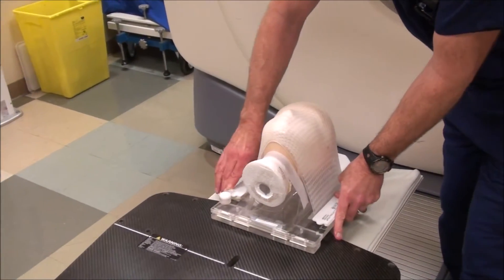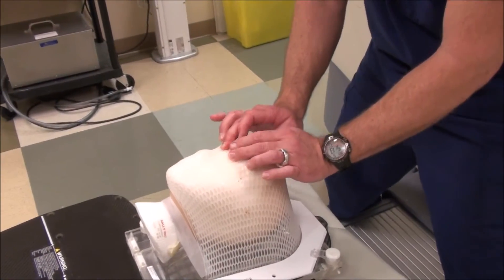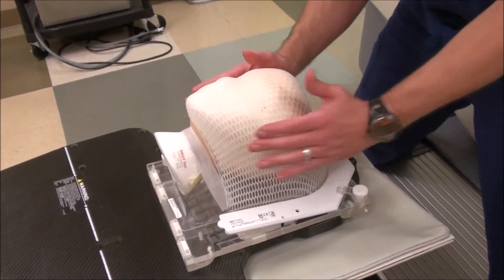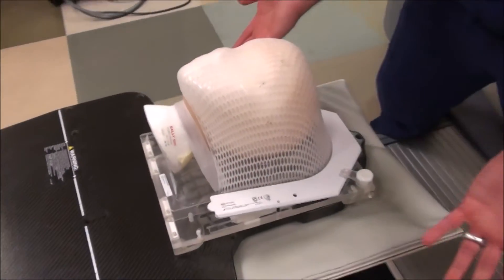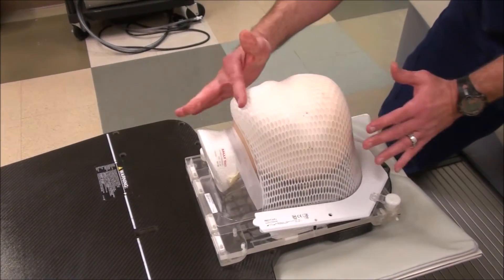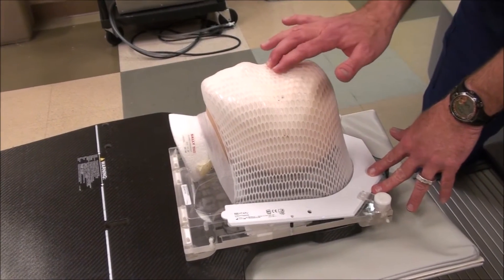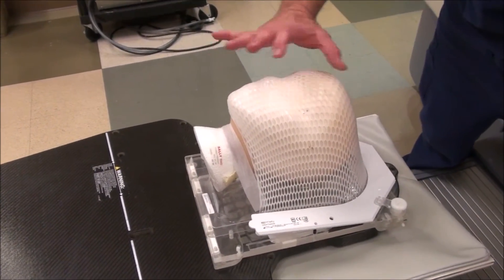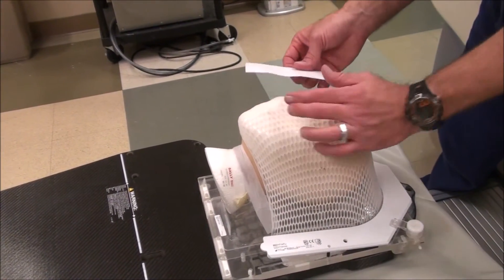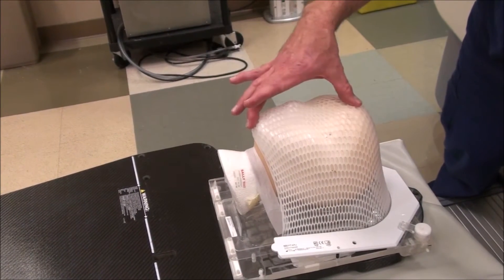This particular mask has little pins that it goes down into. Now you start forming it. You're going to push up like this so that you make a point between the nose and the forehead, such that it goes down into this groove. You're also going to pull up on it a little bit so that it's not so tight on the patient. You want to make a pressure point so that you have a contact point at the chin, across the nose, into the nasion, the glabella, and the forehead. This causes the patient not to be able to tilt their chin back and forth. If you had it bridged across, the patient would be able to move their head and you wouldn't have good contact points to hold the patient in place securely and reproducibly in the same place every day.